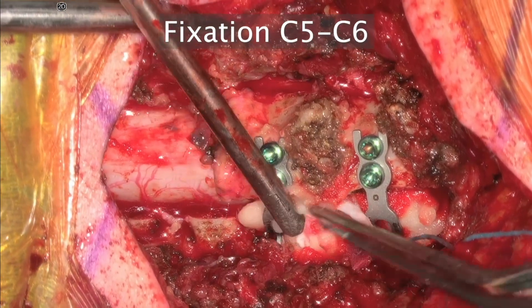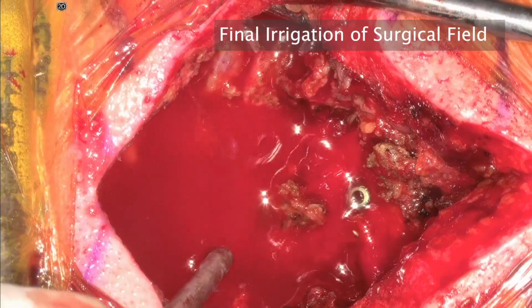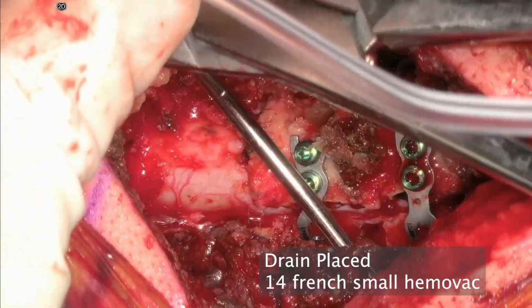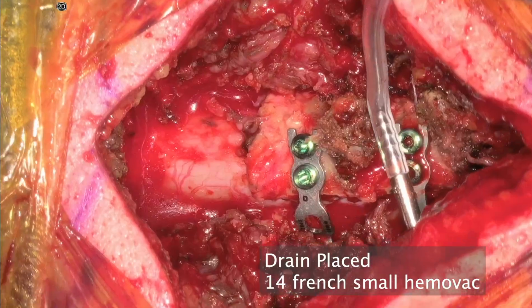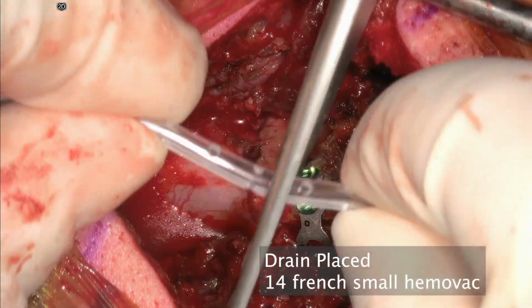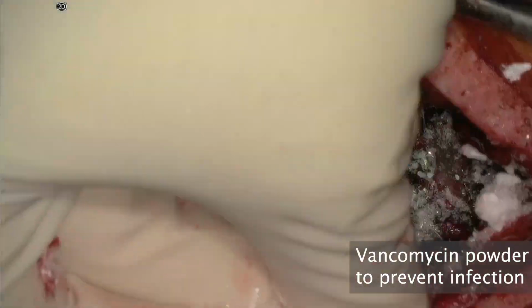As you can see here, by manipulating the patient's head in the Garner-Wells tongs, we have maintenance of motion. Yep, absolutely. I do work with a plastic surgeon here in New York who helps for closure, but really a very thorough closure where you reapproximate all of those paraspinal extensor muscles is really of paramount importance.